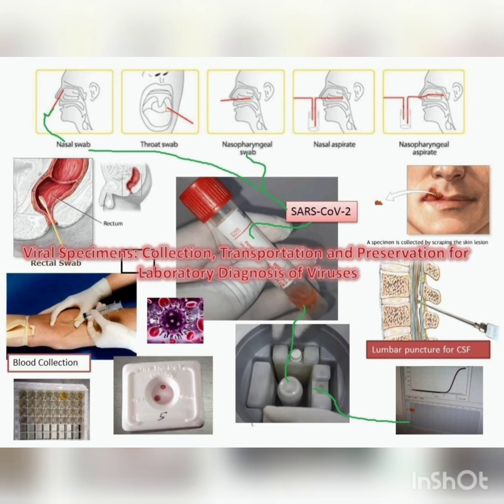Likewise, next is enteric pathogens, especially microorganisms which cause infections in the gastrointestinal system. They are greater in number during the acute or diarrheal stage. So you need to collect the specimens during that stage, because you will find more and more organisms and can make a perfect diagnosis. If you delay, you cannot recognize the organism and you may miss the diagnosis.